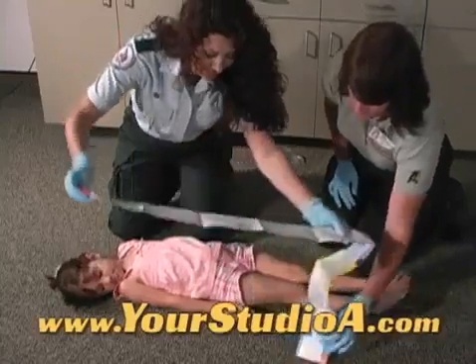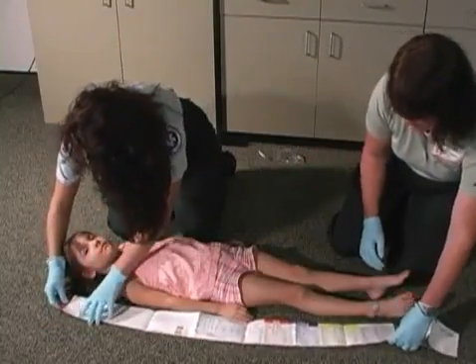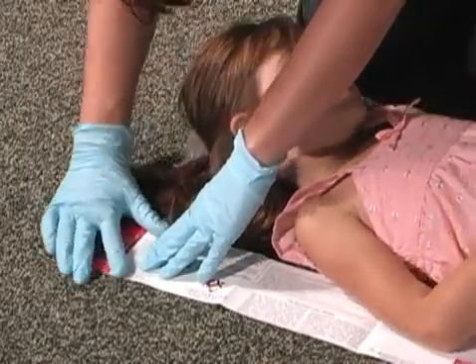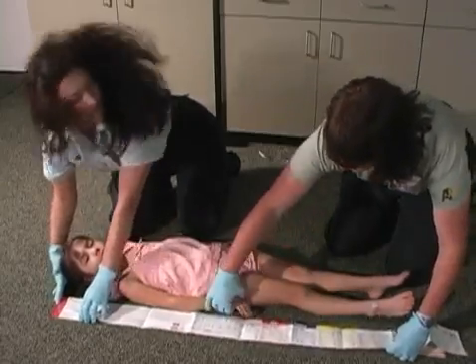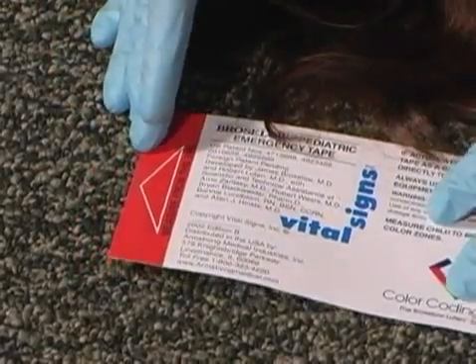Position the Broselow Tape on a flat surface next to the patient with the color-coded or weight side visible. Align the red end of the tape with the top of the patient's head. A red arrow is printed on the tape to indicate measure from this end.